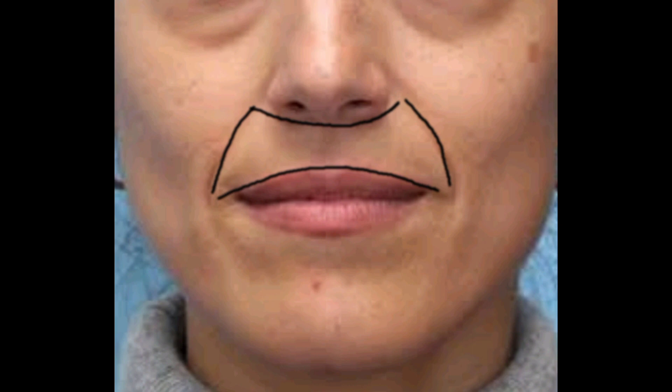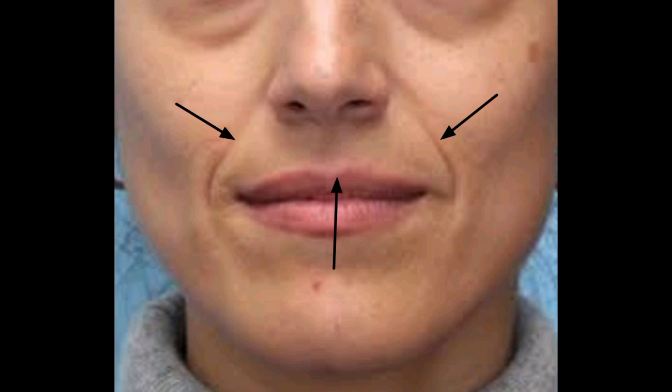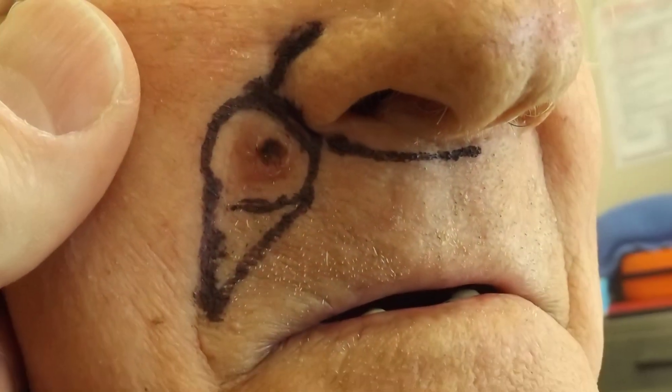The cutaneous upper lip is a relatively small cosmetic subunit of the face, bordered by the nose superiorly, the nasolabial folds laterally, and the vermilion upper lip inferiorly. Treating skin cancer here may be difficult due to the potential to distort the nasolabial folds and upper lip. With large lesions it may be necessary to repair the excision defect with a full thickness skin graft; however, a skin graft in this area may not have a desirable cosmetic outcome.